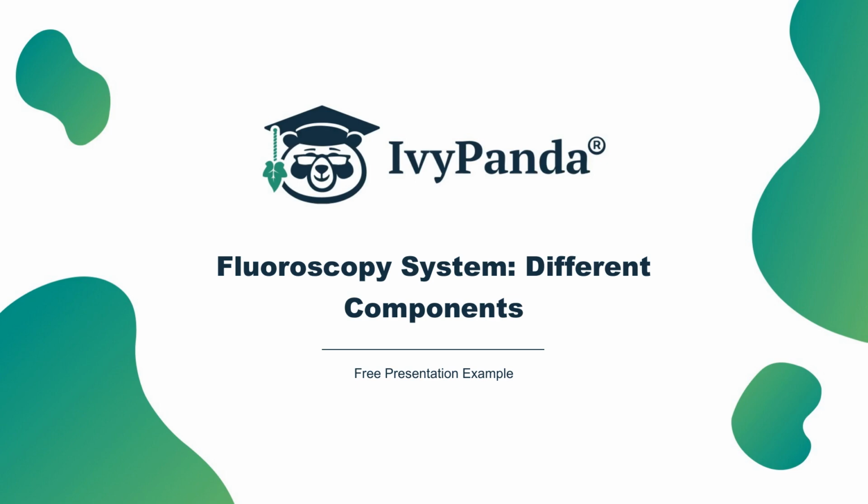Photodetectors and TFT arrays. There are two types of photodetectors used in indirect conversion systems: amorphous silicon photodiode arrays and charge-coupled devices, or CCDs. The role of photodetectors is to convert light energy into electrical charges. After that, these electric charges are transmitted to the TFT arrays, which, in turn, capture and isolate these pixels, convert them, and transmit them to the image processor for display. The charge can be released and read if a high potential is applied at this stage. In such a way, an image appears on the screen.